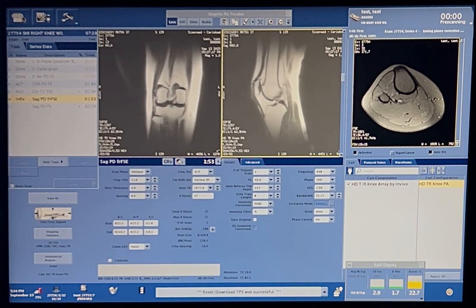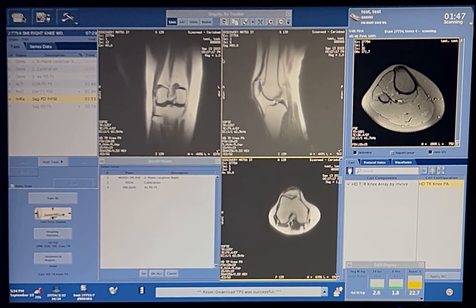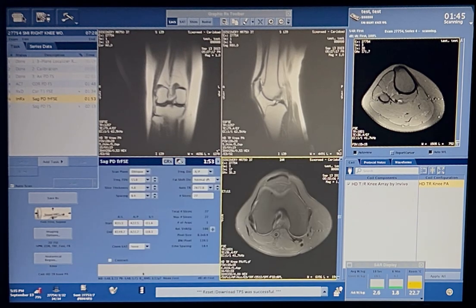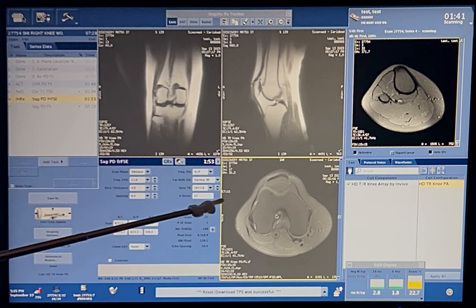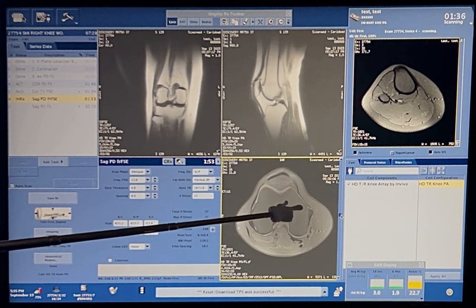So remember it was quiet. What does that mean? Yeah. There you go. Find our money slices. So you have your lateral condyle, lateral epicondyle, medial condyle, medial epicondyle.